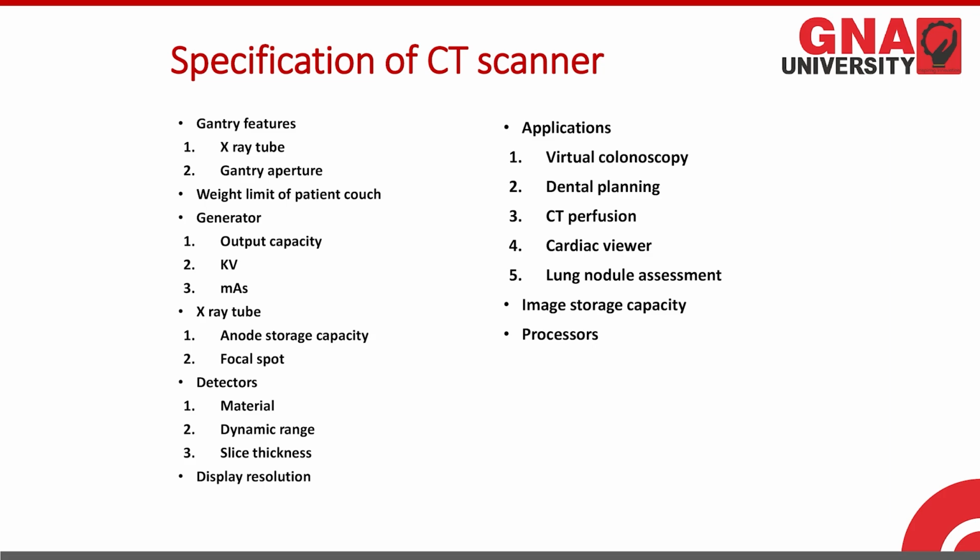Now for the applications, CT has some complex applications like virtual colonoscopy, dental planning, CT perfusion, cardiac viewing, lung nodule assessment, image storage capacity and processing. So this was the end of the CT instrumentation. Thank you so much.